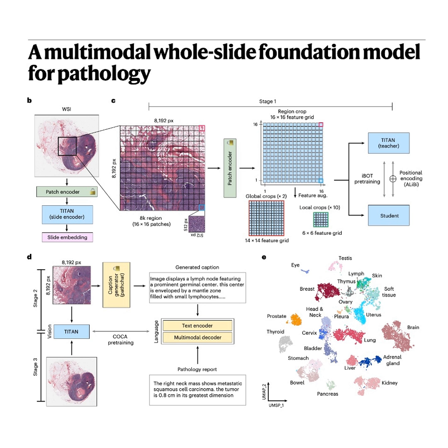That's a crucial question, and it really gets to the limitations of real clinical data. Pathologists write reports for diagnosis, for treatment, so a typical report gives a high-level summary: invasive ductal carcinoma, grade 2. Pretty concise. Very. It rarely includes those microscopic fine-grained details like cells exhibit marked nuclear pleomorphism with irregular chromatin clumping. I see. So the actual reports provide the answer, the final diagnosis, but the synthetic captions provide the reasoning.